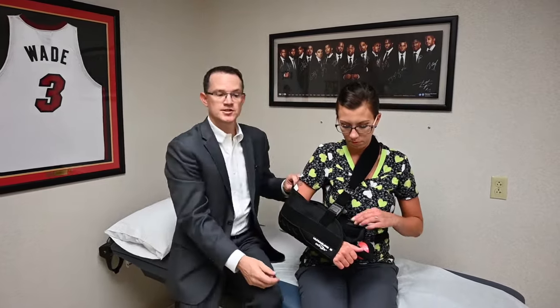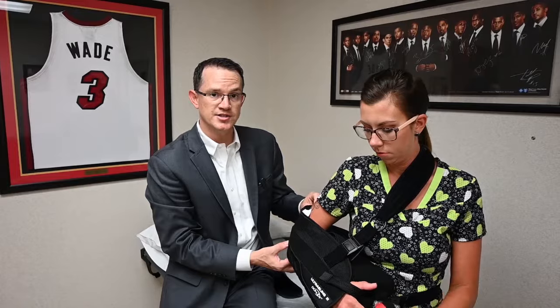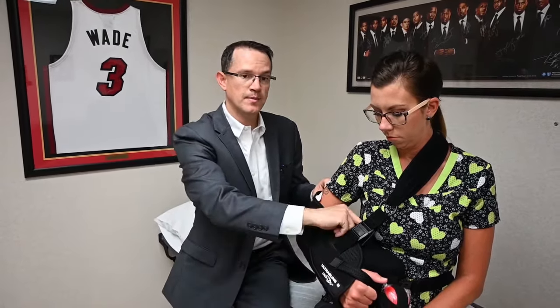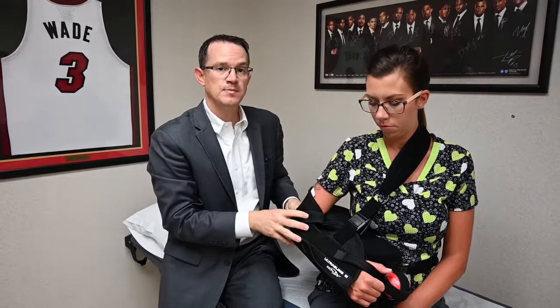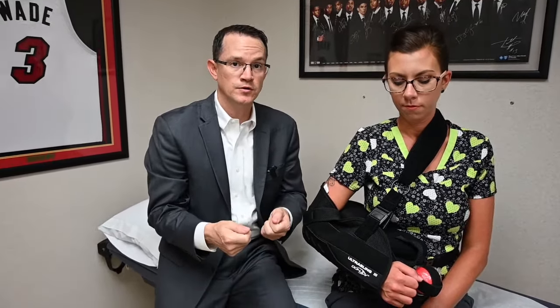When putting the sling back on, make sure the elbow is all the way back and snug into the back corner of the brace so it's not sliding too far forward. Then replace the thumb strap and the strap up over the top. You can remove the thumb strap whenever you want for comfort — I encourage patients to use their hand for normal activities of daily living such as typing, using the remote, or preparing food. What we don't want is for you to be lifting with that hand, so avoid loading up and carrying things with your operative arm.